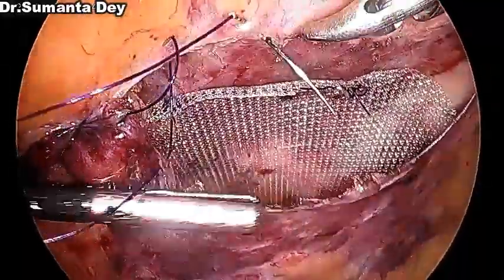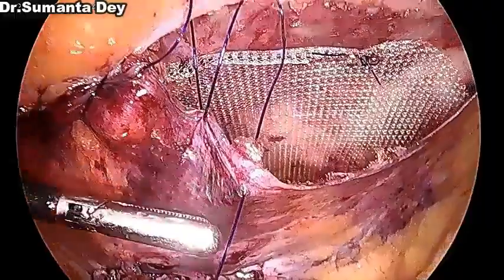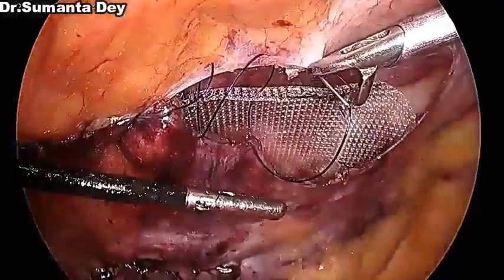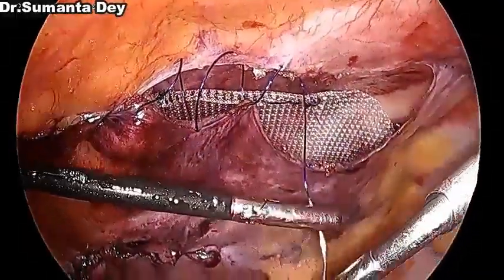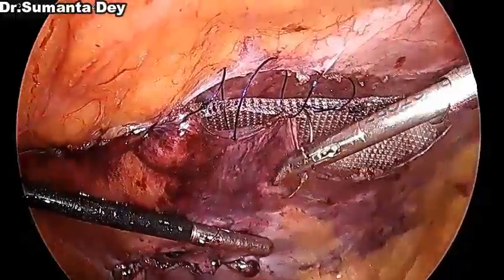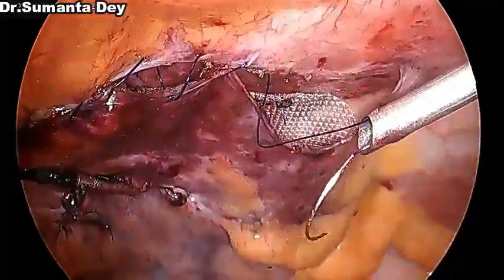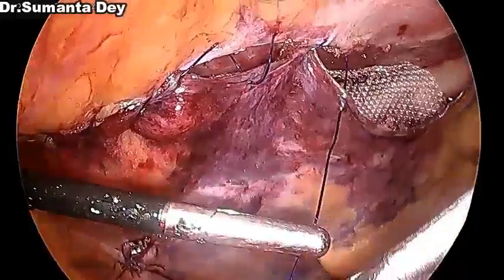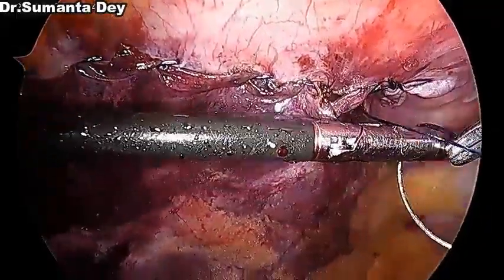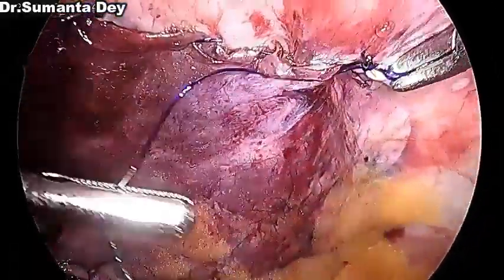You can see I'm taking a few throws of PDS through the peritoneum, 3-4 bites, and then pulling the suture so that it sits nicely. I have seen surgeons closing the peritoneal flap with barbed suture, but I felt it is not necessary, because it can be easily closed by PDS, and again there are cost issues. The barbed suture has its own side effects, where the bowel can get entangled with the barbed thread and cause postoperative intestinal obstruction.